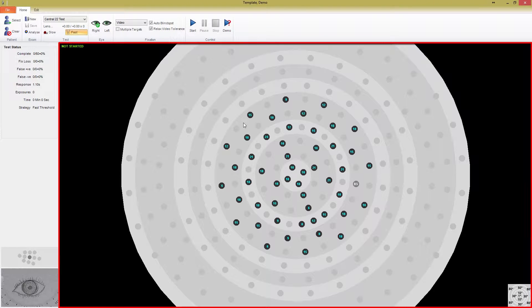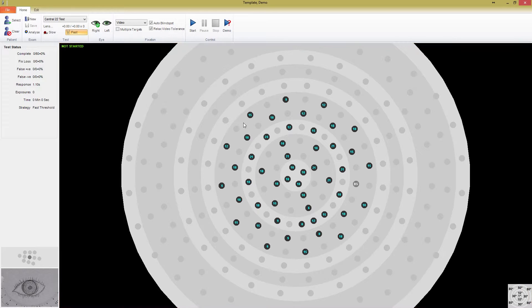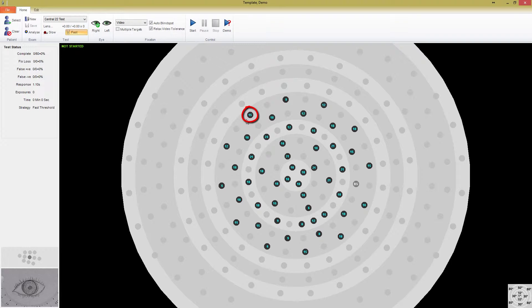The first thing you should notice is that the majority of the test window is filled with the representation of your perimeter, showing all of the points that make up the testable field. Points shown as a small black circle with a number inside are stimulus locations that will be tested in the current test.